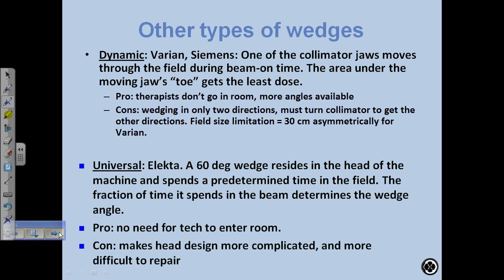Okay, other types of wedges. Dynamic wedge. We know about dynamic wedge. We've always used them, right? You guys use them in IROC? Dynamic wedges, kind of how it works? Talked about it. Okay, did you actually program them in the machine and use them? You didn't? Okay, we'll talk about that.